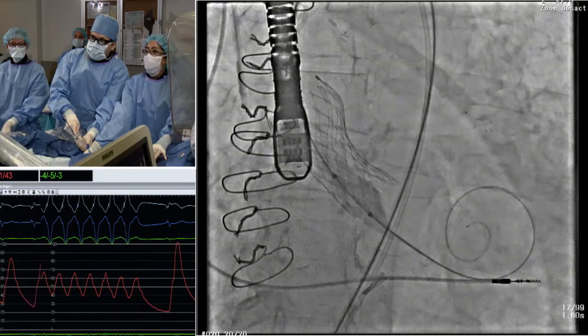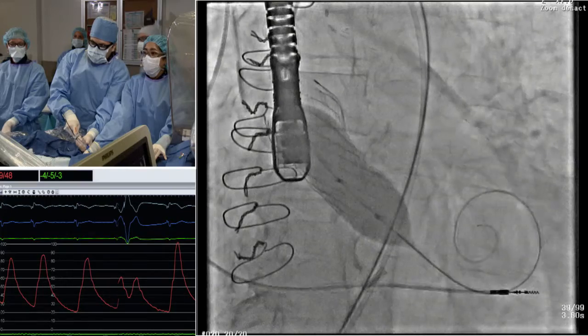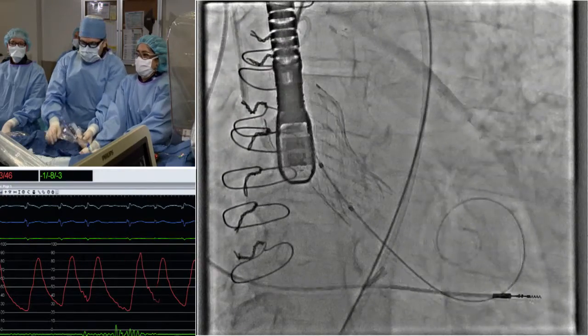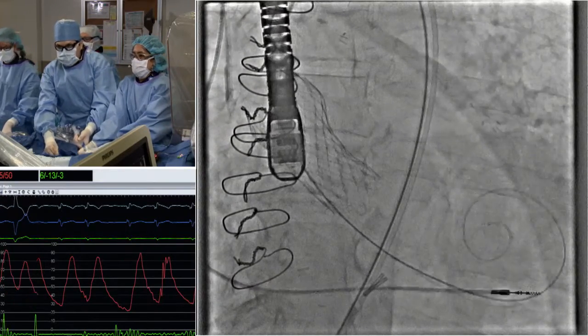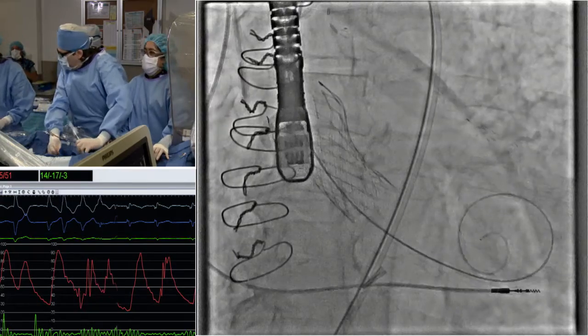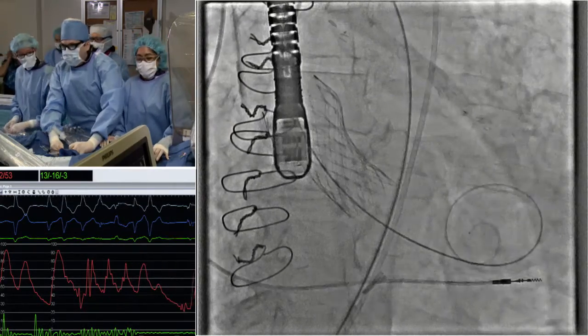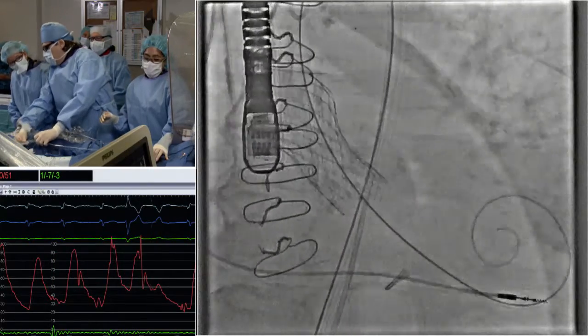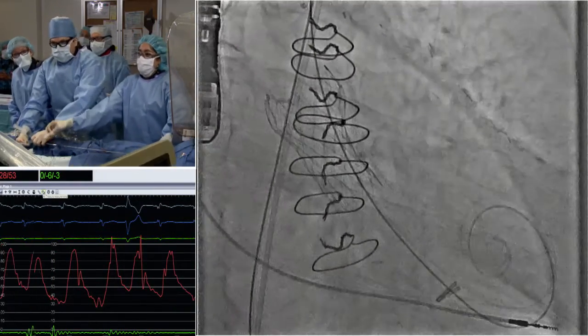Is it on purpose, Anita, that you use a balloon that has somewhat of a dog bone shape? Well, I just find that it moves less. That is the Nucleus balloon? It does tend to move a little bit less. I would argue that does look a bit better, but we're going to go into the RAO view just to see. Peux-tu juste descendre un peu, Patrick, pour voir? I think the expansion is better, huh? Yeah, I agree. But we'll see in the other view. Attendez. Ouais, vas-y.